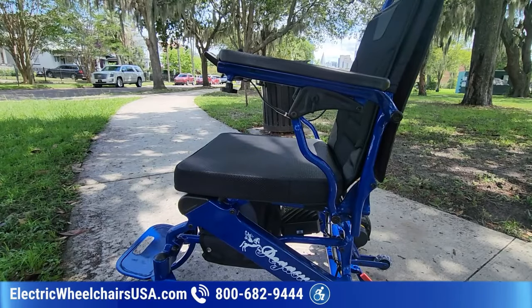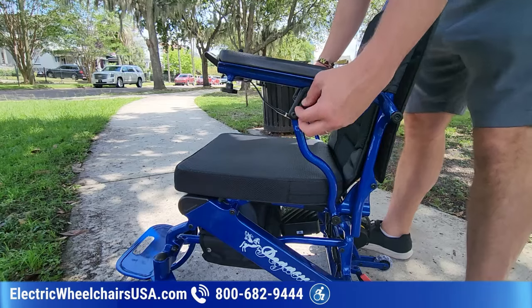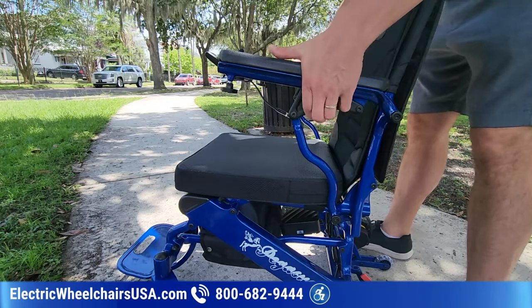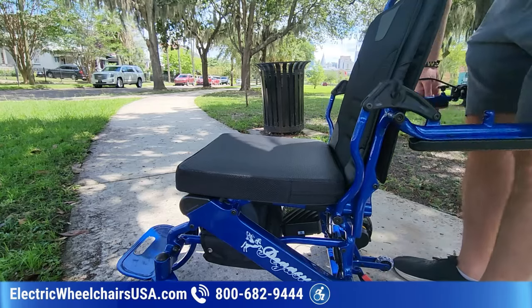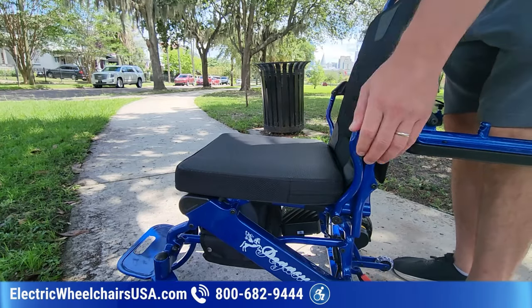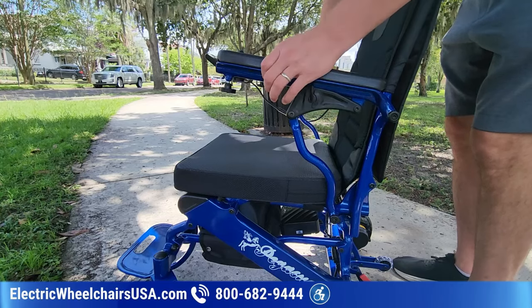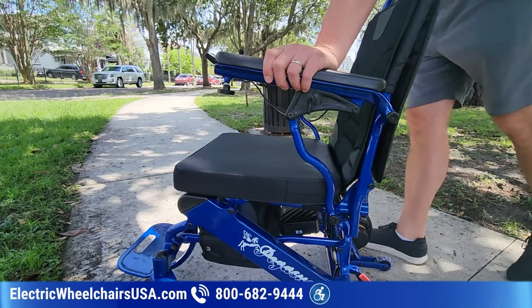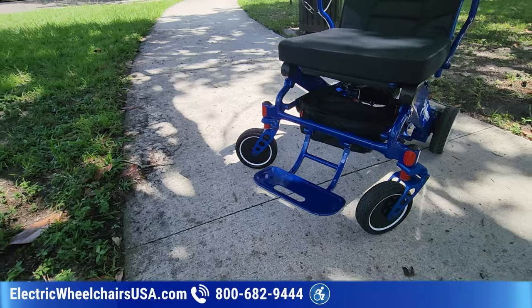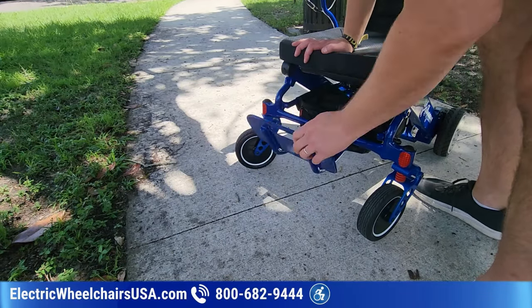Now, as far as the armrests, they do flip up for easy entering or exiting the seat. You just flip these tabs up and you can flip it right up and actually pull them all the way back. It's good for transfers in and out of the seat. And then to lock them back into place, you have to pull these tabs back down, which will lock them into place.